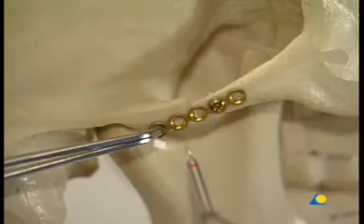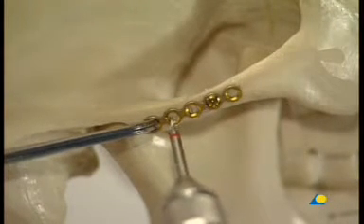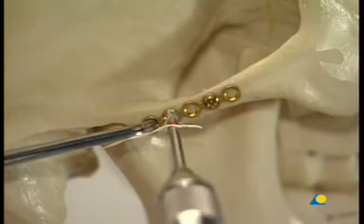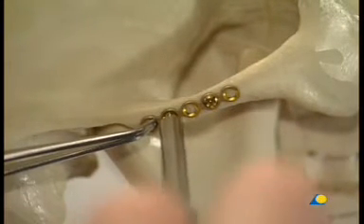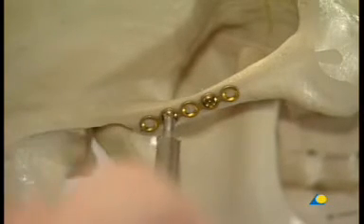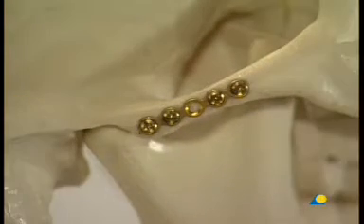Another screw is inserted on the opposite side of the fracture line. Traction on the plate can be used to achieve a better reduction of the zygomatic arch. Two more screws are inserted, one on each side of the fracture line.